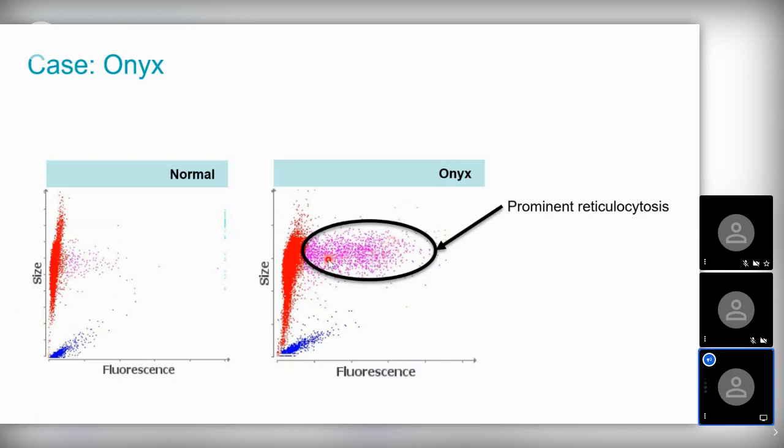Whereas the red blood cells, hemoglobin, and hematocrit, all three have reduced. So this takes us to the conclusion that it is a moderately severe regenerative anemia. So let's have a look further at what it's going to be.